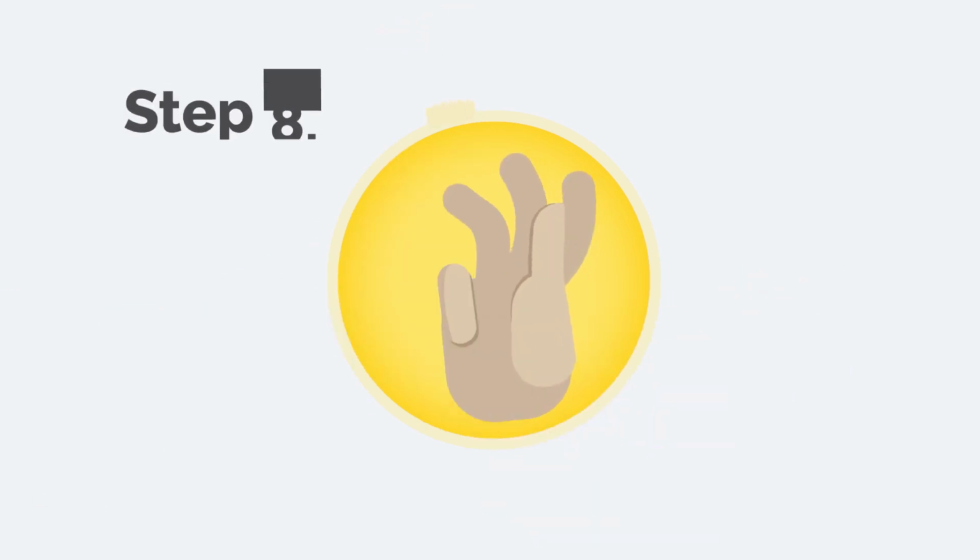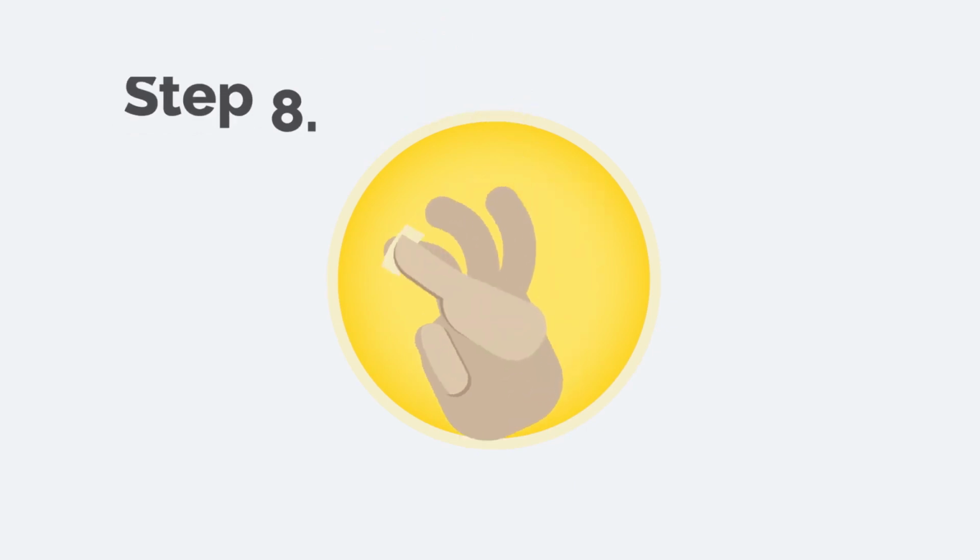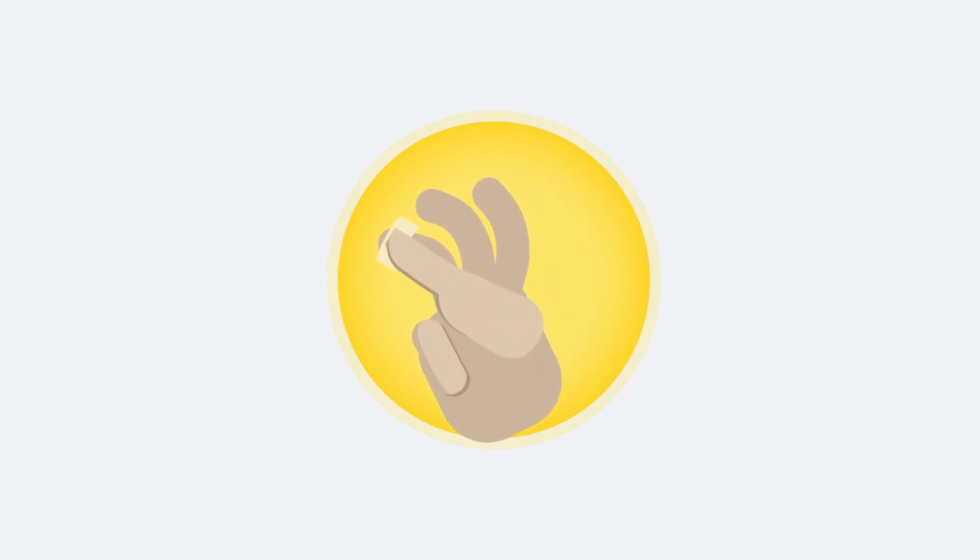Gently press your finger into an alcohol pad or tissue paper for 5 to 7 seconds to stop the bleeding. Avoid simply wiping it, as sometimes this won't seal the puncture.